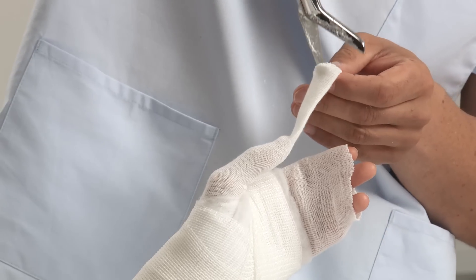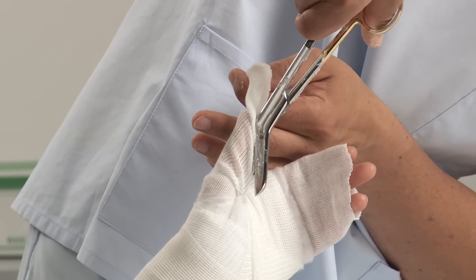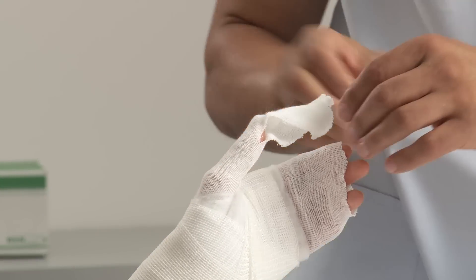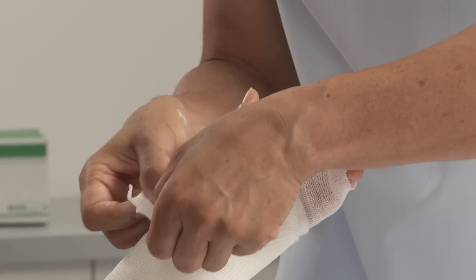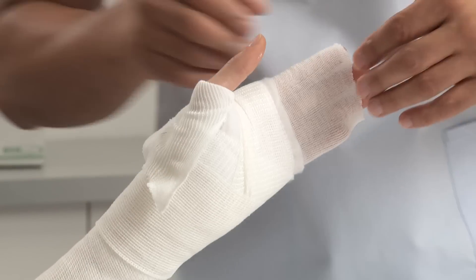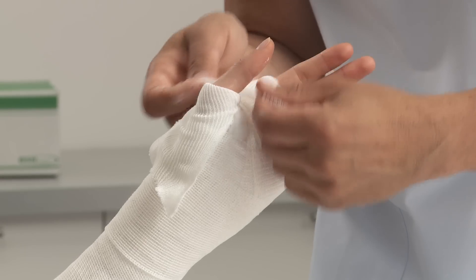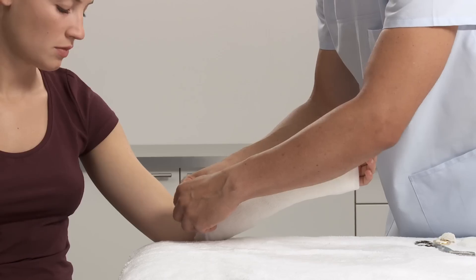Cut into the thumb stockinette and fold down. Fold down the arm stockinette at the distal and proximal ends. This will provide smooth edges and comfort.